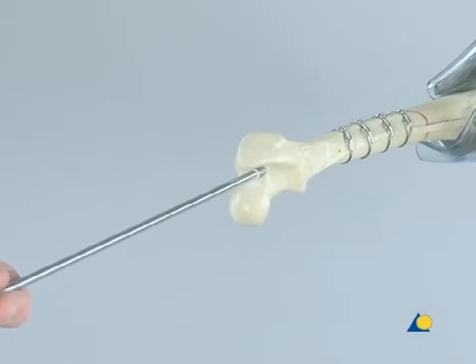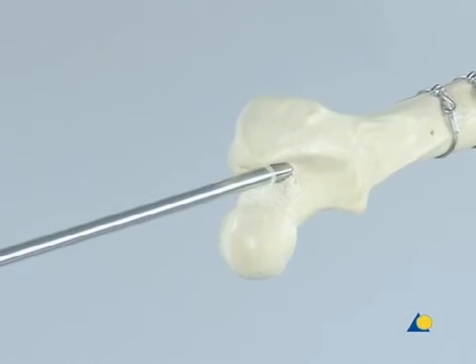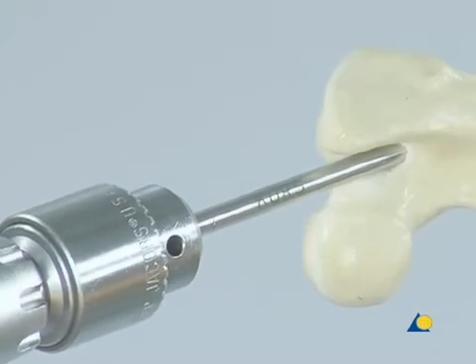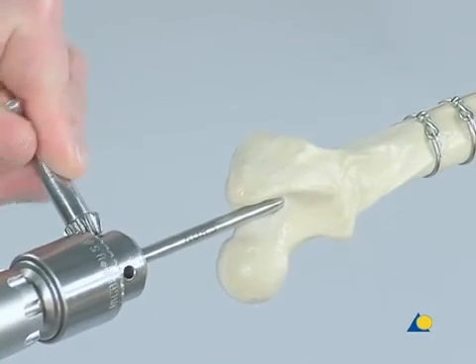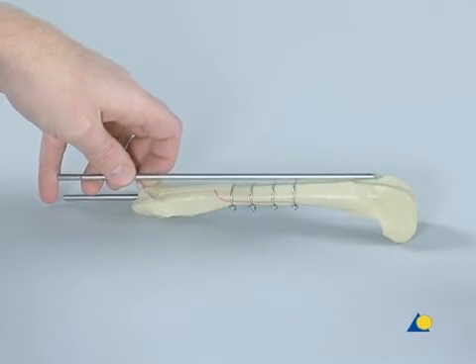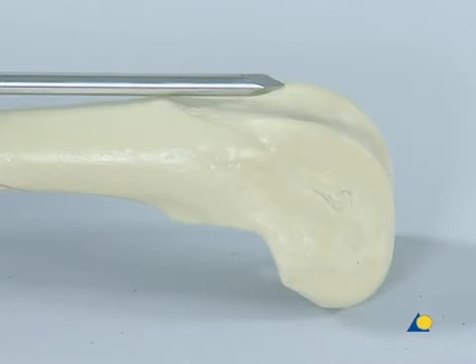Once the tip starts penetrating the bone, the pin is directed towards the patellar region and driven distally along the caudal cortex of the femur. There will be an increase in resistance when the pin penetrates the distal metaphysial region. This is the time to check the depth of penetration, so the pin is released from the chuck. To verify the depth, another pin of the same length is held alongside the visible portion of the pin that protrudes from the bone. The end of the pin should lie at the proximal edge of the patella and must not penetrate the articular surface.